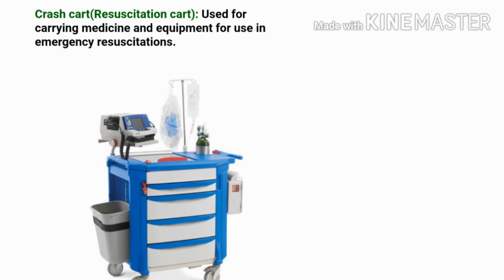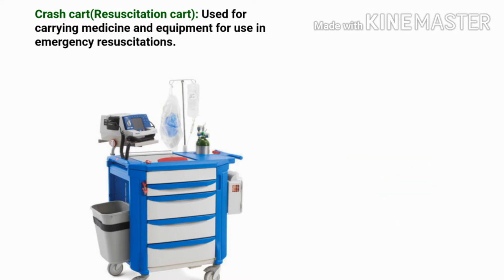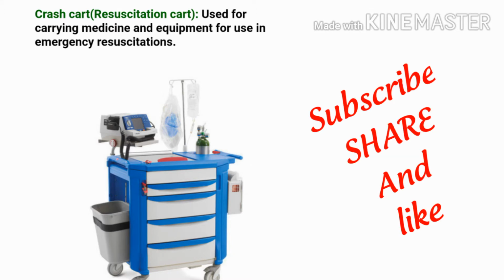And this is the crash cart, also known as the resuscitation cart. It is mainly used for carrying medicines and equipment for use in emergency resuscitation. This trolley is not only used in ICU setups but also in normal wards. So this is the crash cart or resuscitation cart.